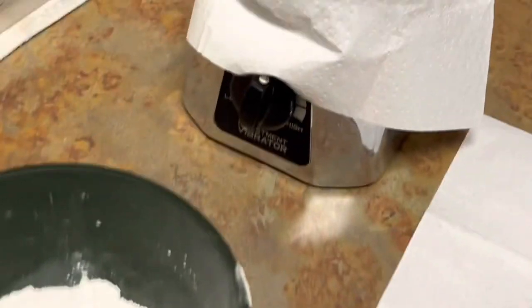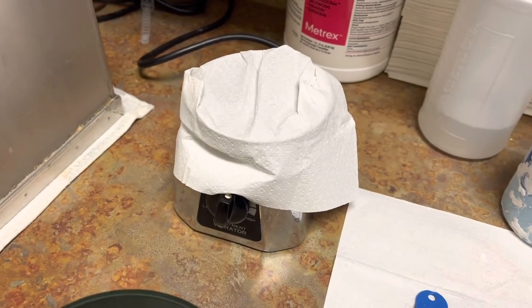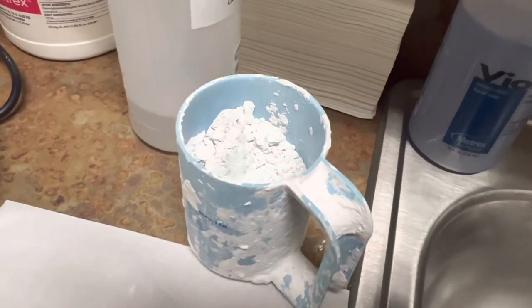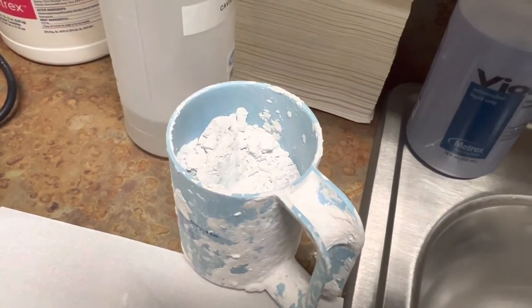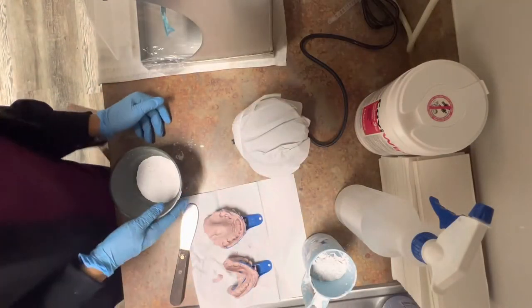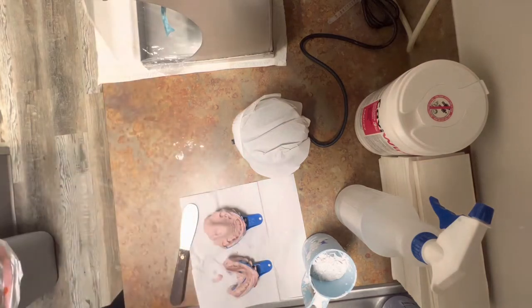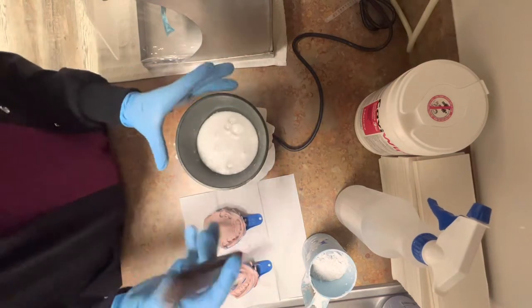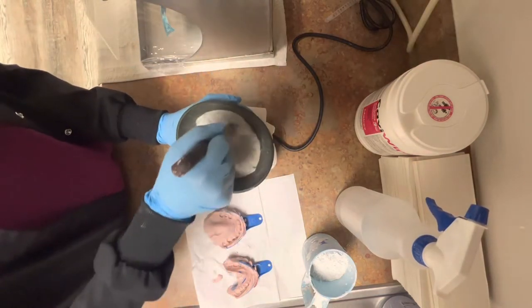I have my spatula, my stone, and the vibrating machine. I put a napkin over it just so I won't make a mess on the machine itself. And then we have a cup filled with stone. The main reason why you want your impressions to be dried is so you don't get any air bubbles. We do not want any air bubbles at all in our impressions.